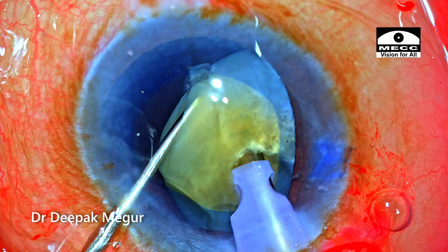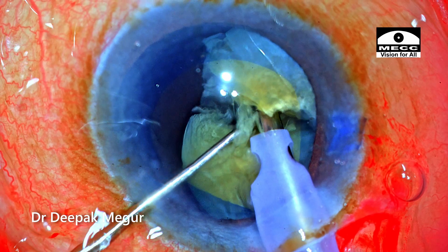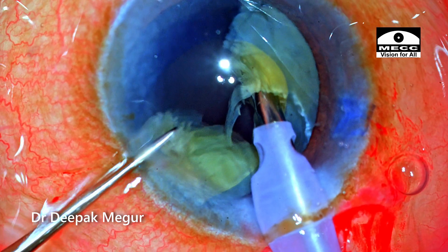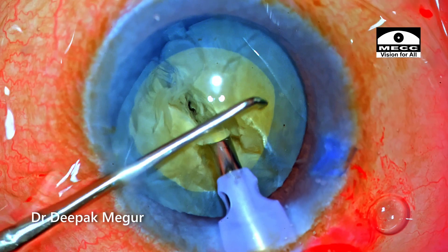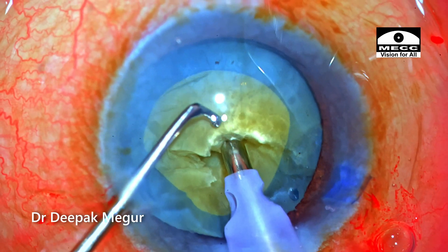Care is taken that the lateral separation maneuvers are not extended beyond the midpoint — only the distal part of the nucleus is cracked, which is fine because the rhexis is small and the bag is empty. I don't want to put any more stress, so I stop at this point, rotate the nucleus, and continue the chopping maneuver.